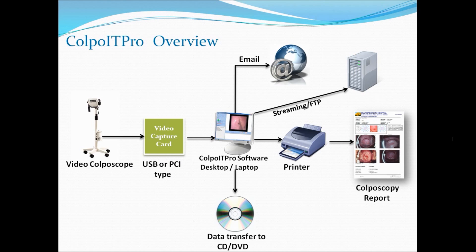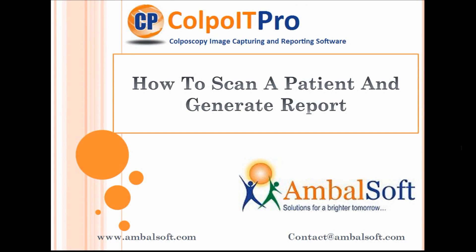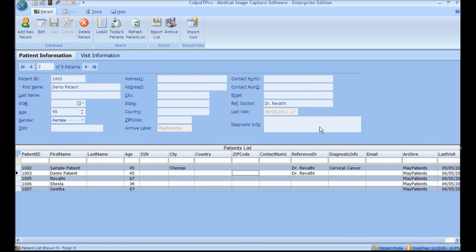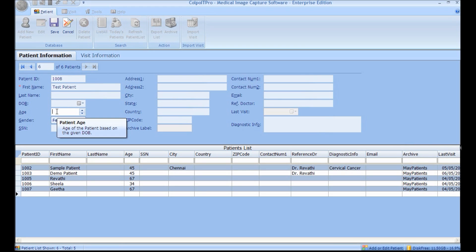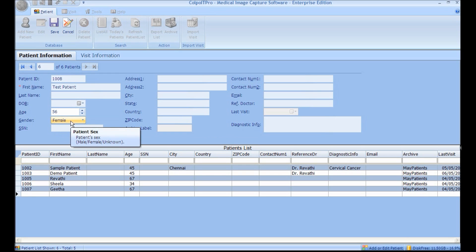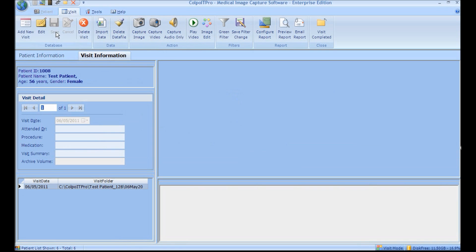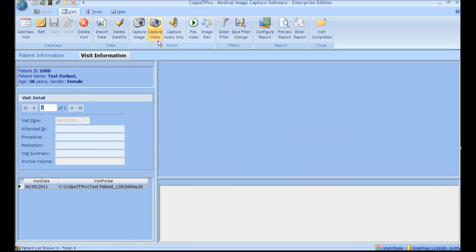Now let's look at the basic functionality of the software. Patient information screen: to enter a new patient, click Add New Patient and enter the patient details. Here, only the first name is a mandatory field. By default, the gender is female. Click Save after entering the details. On clicking Save, the screen focuses on the visit information screen.